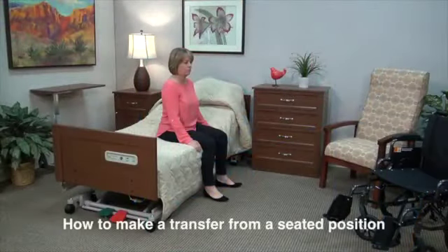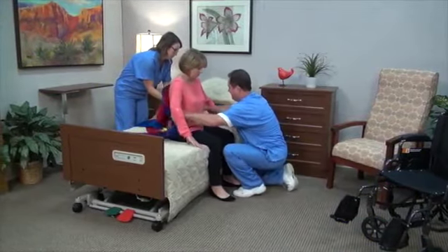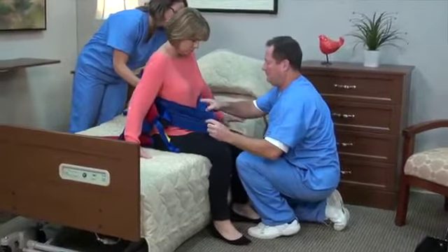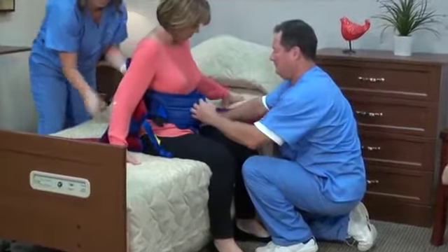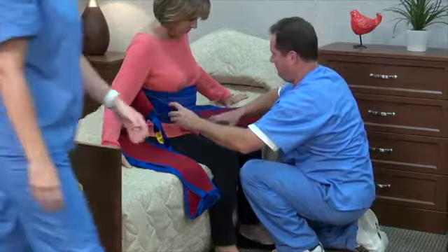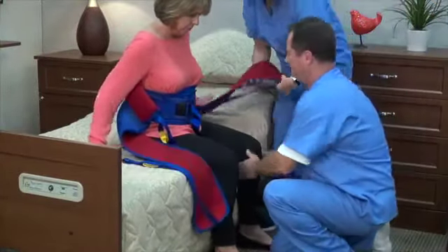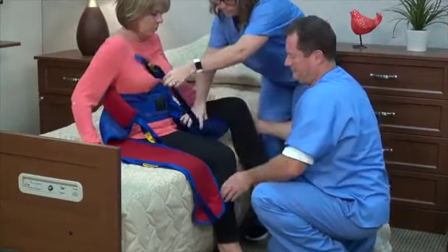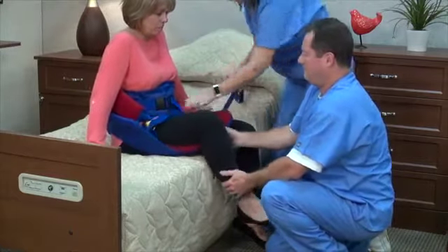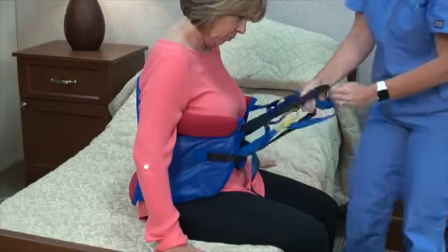How to make a transfer from a seated position — from bed to wheelchair — with a deluxe sit-to-stand padded sling: position the sling behind the back with the two red pads under the arms and the single red lumbar pad against the small of the back. Make sure the adjustment straps are on the outside. Cross the padded sling below the chest and secure the buckle, adjusting for comfort as required. Place the two loops through the black strap in the form of an H in front of the resident.